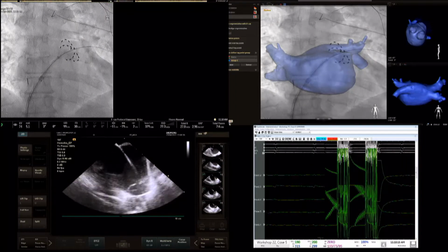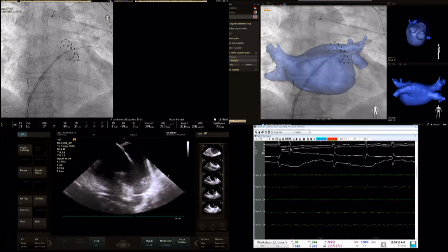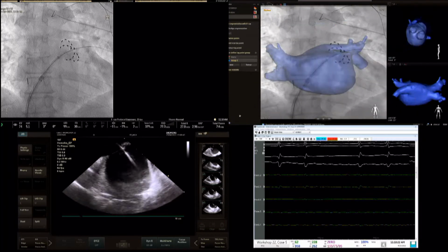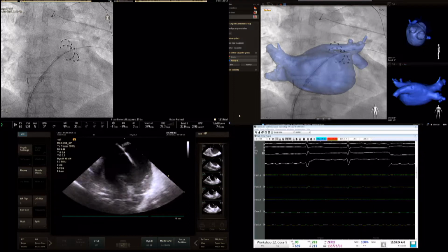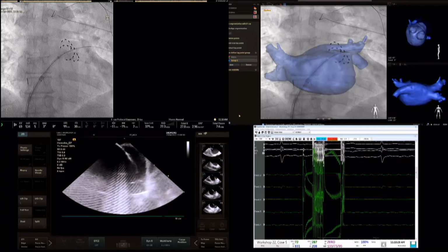Okay, so there are all the pulses in this position. The patient didn't move too much, and it is very nice in a quiet position. So let's go. Charge, please, to make it faster.